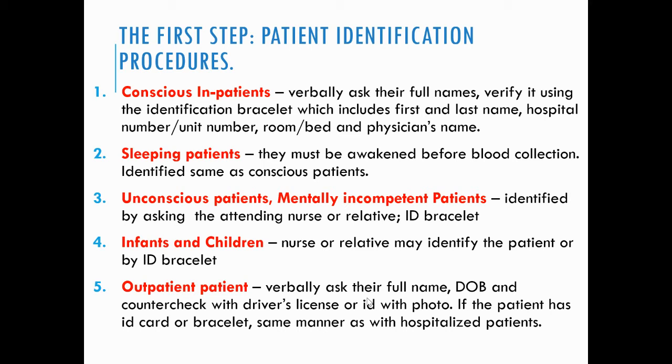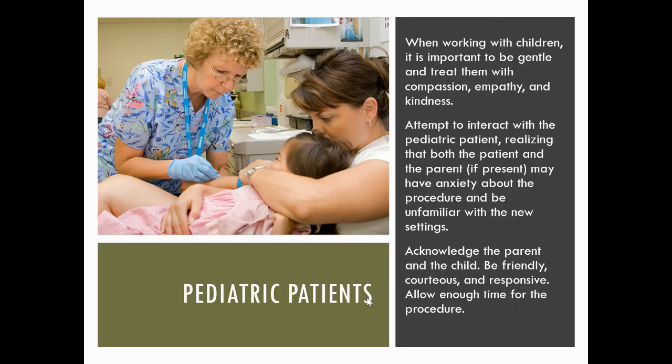Now, outpatients. So we need to again verbally ask their full names. These are the walk-in patients, those who come with a laboratory request to have their blood samples processed, or who feel unwell, or who will undergo a check-up. And also, counter-check them with any valid IDs that they have with a picture. If the patient has an ID card or bracelet, it is the same manner as with the hospitalized patients.